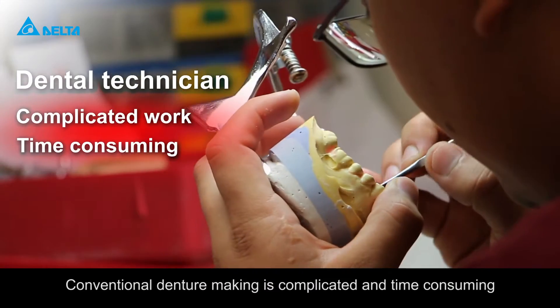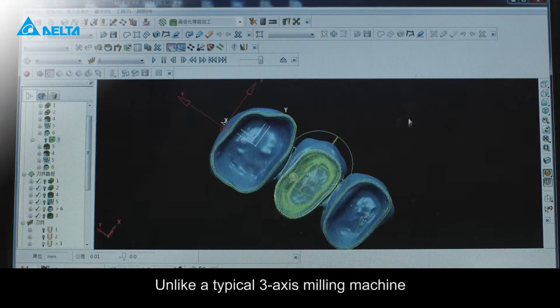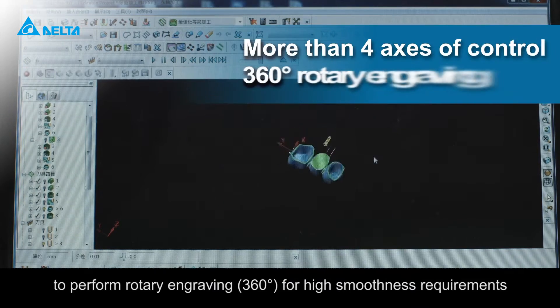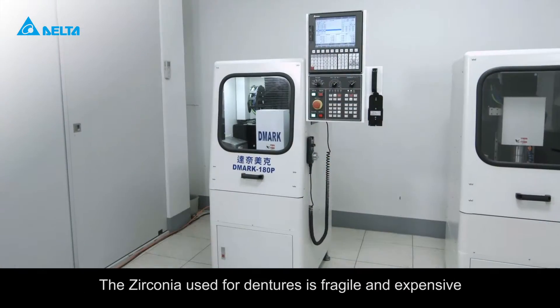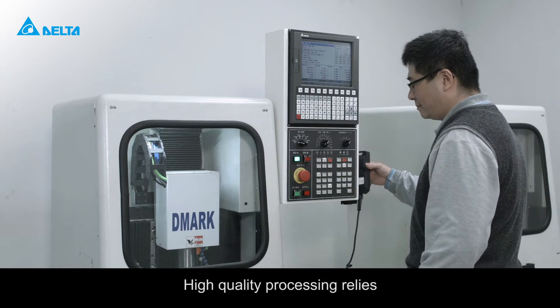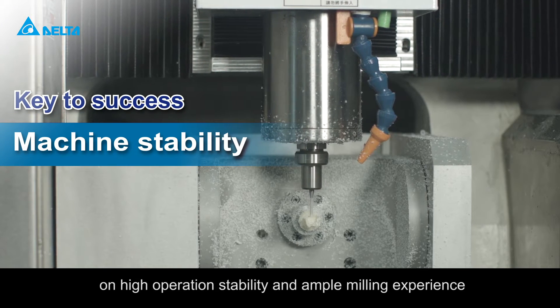Conventional denture making is complicated and time-consuming. Unlike a typical three-axis milling machine, a dental milling machine requires over four axes of control to perform rotary engraving for high smoothness requirements. The zirconia used for dentures is fragile and expensive. High quality processing relies on high operation stability and ample milling experience.